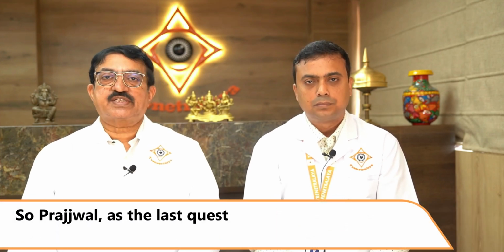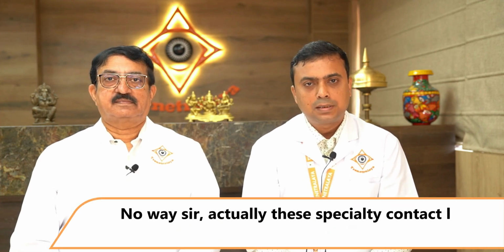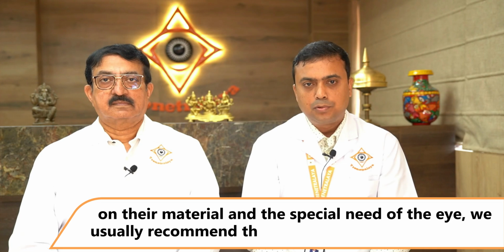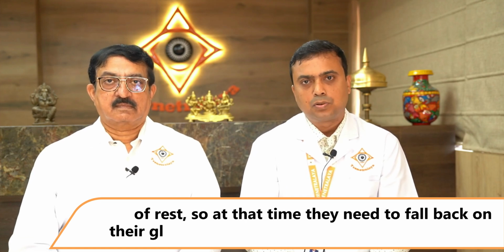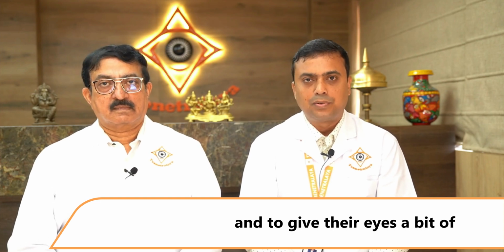So Prajjwal, as a last question, I would like to ask you, so these are specialty contact lenses. Do they actually completely get rid of glasses? No way, sir. Actually, these specialty contact lenses are advised to be worn for 10 to 12 hours a day, depending on their material and the special need of the eye. So we usually recommend them to use it less than 10 to 12 hours a day only. So after the removal of these lenses, when they come back home, eyes also need a little bit of rest. So at that time, they need to fall back on their glasses. So glasses have to be there for backup and to give their eyes a bit of rest.